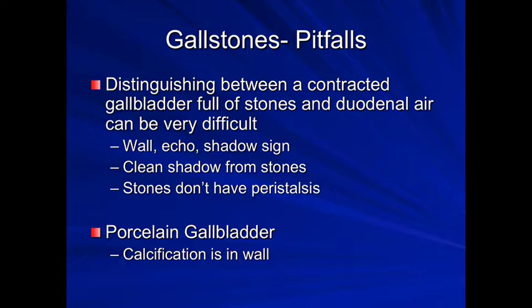Finally, the other thing you can use to help distinguish them is if you watch for long enough, you may see the gas move as a wave of peristalsis comes through. Stones, of course, will not demonstrate this.